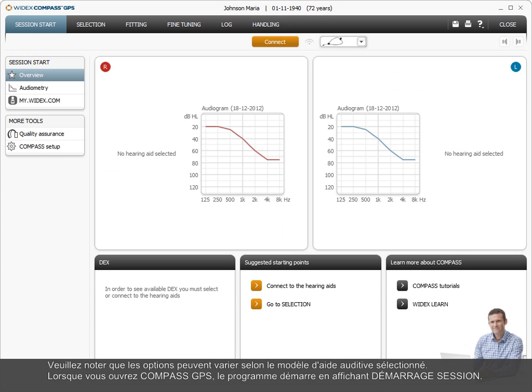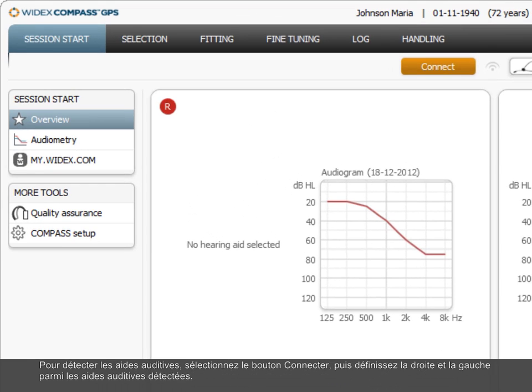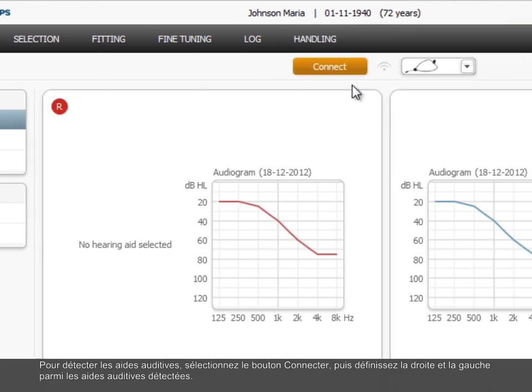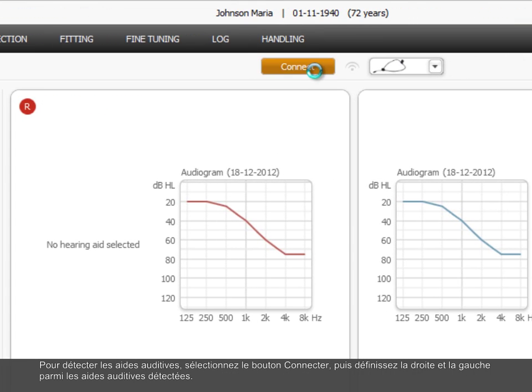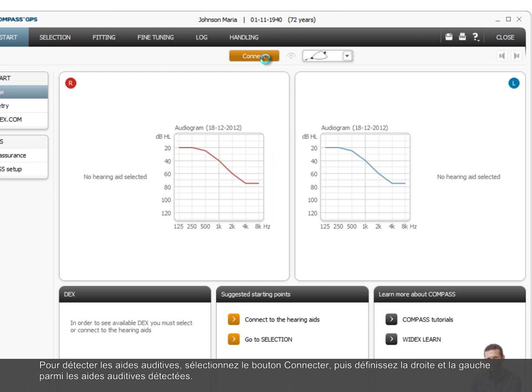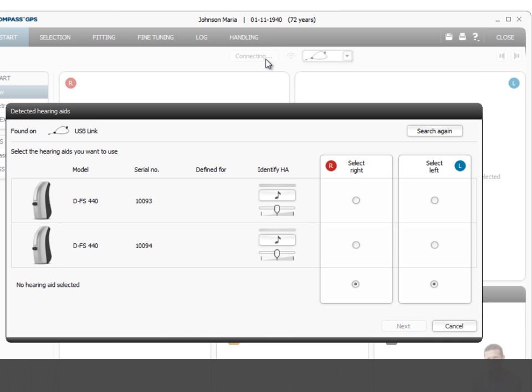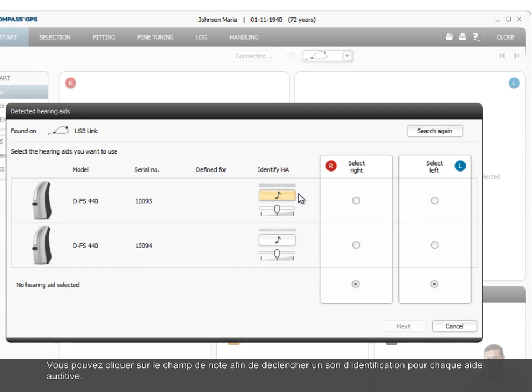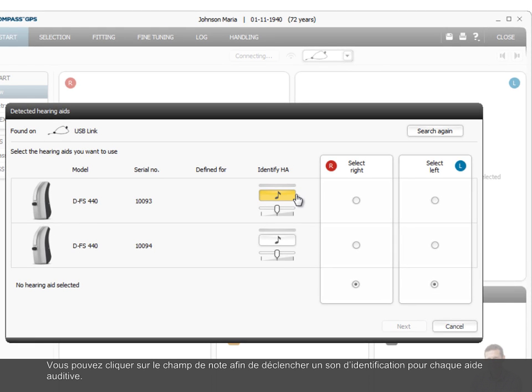When you open Compass GPS, the program starts up by showing the session start. To detect the hearing aids, select the connect button and then define right and left for the hearing aids detected. You can click the note field to trigger an identifying tone for each hearing aid.